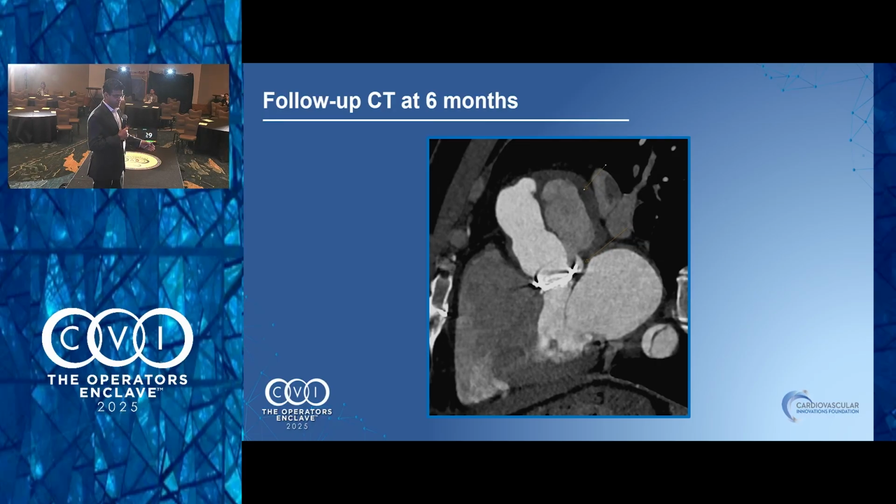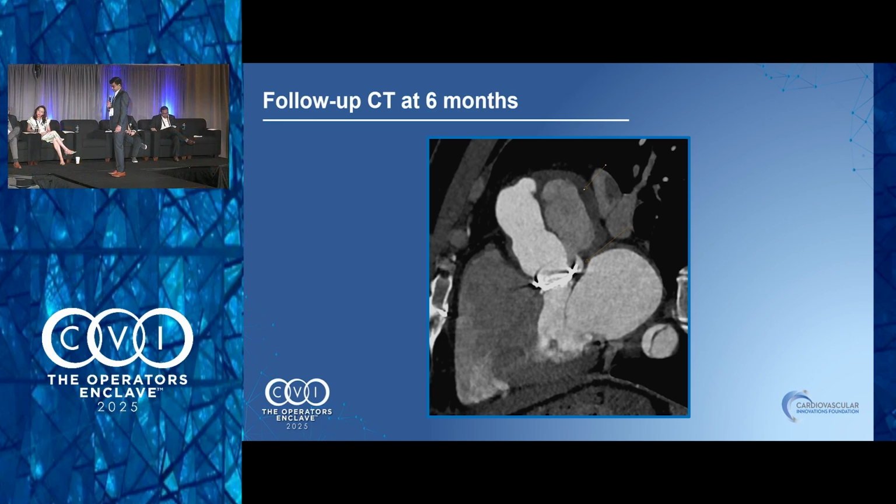So the question is, is it a paravalvular leak that's leaking around and going to the sac, or is it a suture issue that happened? But I can't get more than that. You don't see the actual entry point to the pseudoaneurysm? Not on CT. Well, you can see the suture line a little bit above the ST junction where the Bentall ends. So it's not at the distal suture line. Maybe at the proximal.